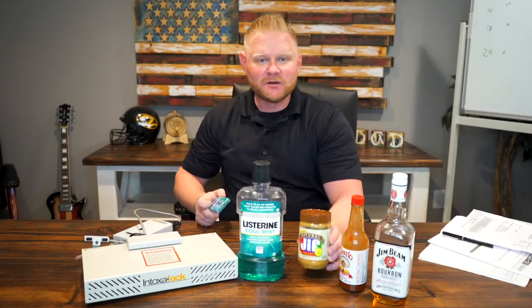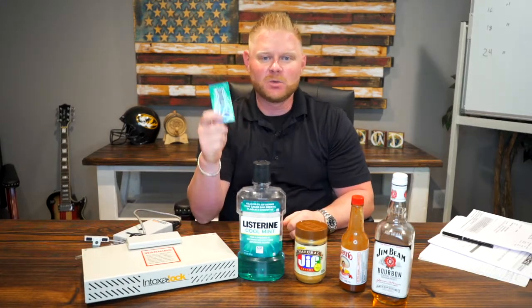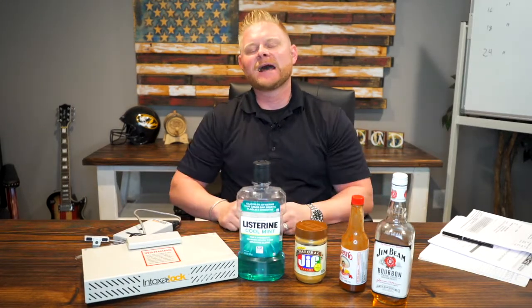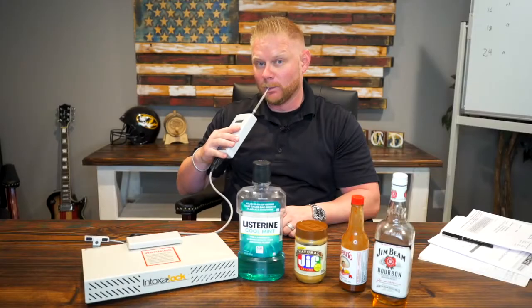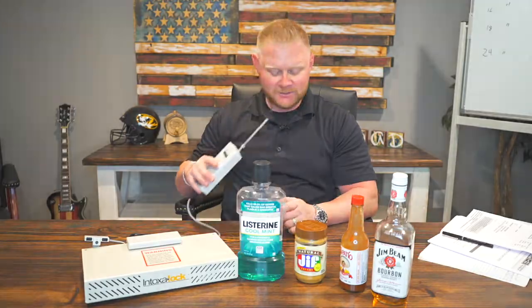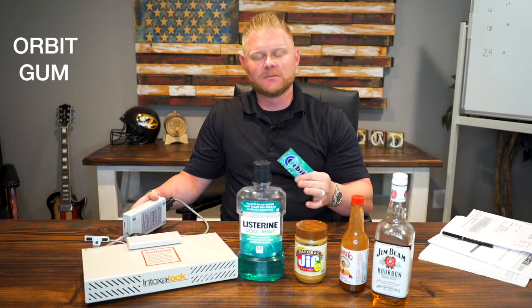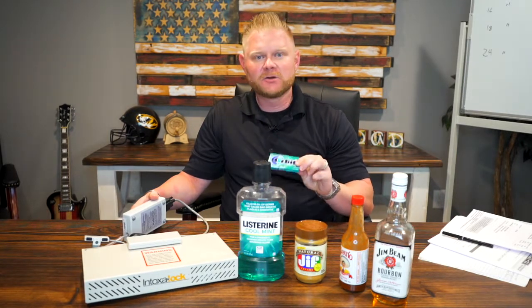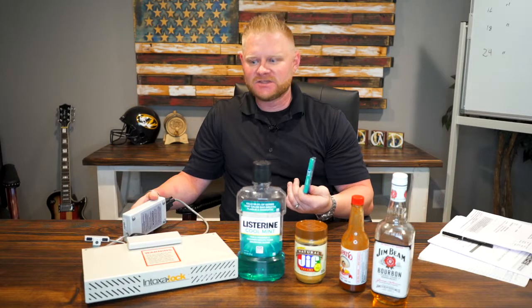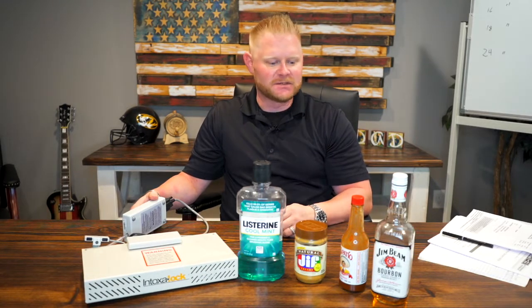Though by the end of this video, there's no guarantee of what could be happening here. The third one is going to be wintergreen gum. We're going to check that out real quick and see exactly what the results are. The number 3 result, Orbit Gum, had no effect on the blood alcohol content. Orbit Gum, this was wintergreen. It supposedly is supposed to alter what your test shows, and it did absolutely nothing.